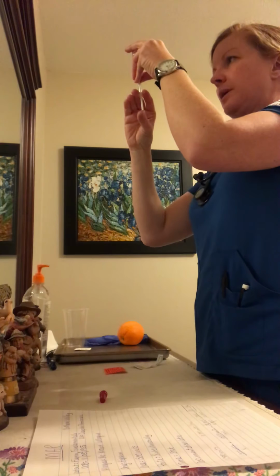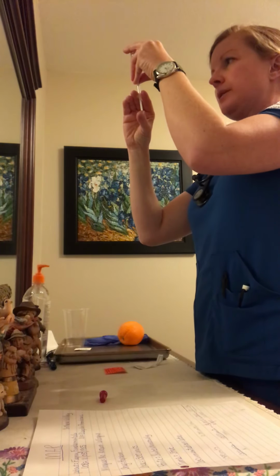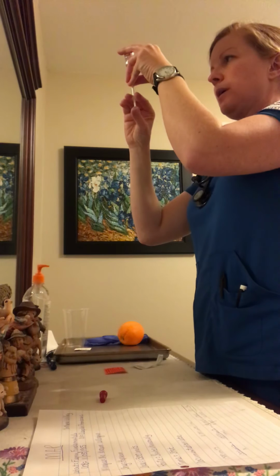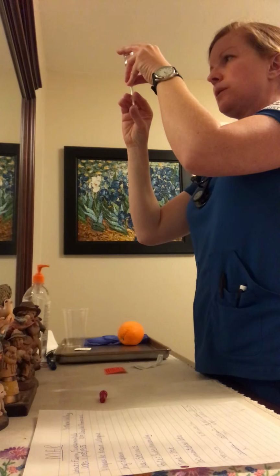We are now going to be measuring 0.13 milliliters heparin.